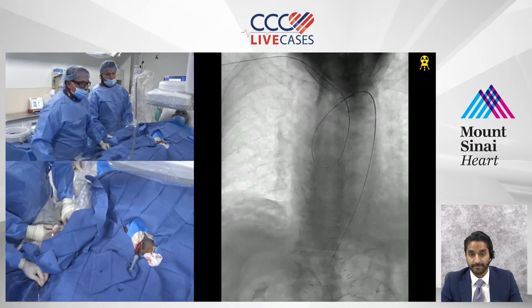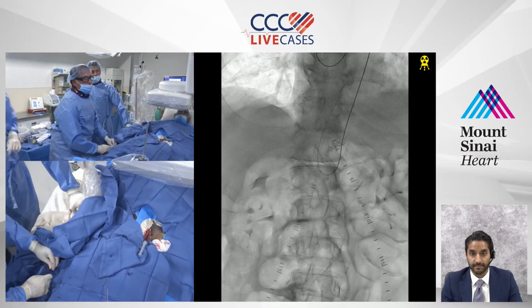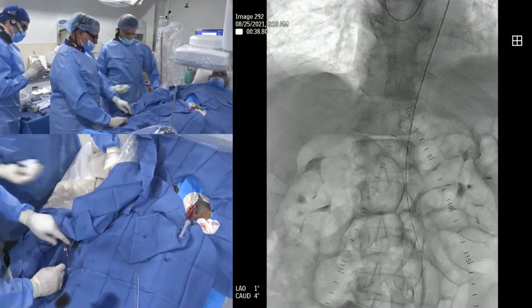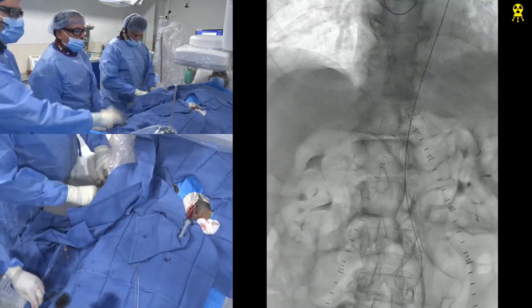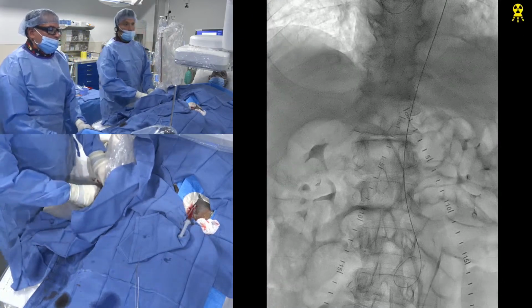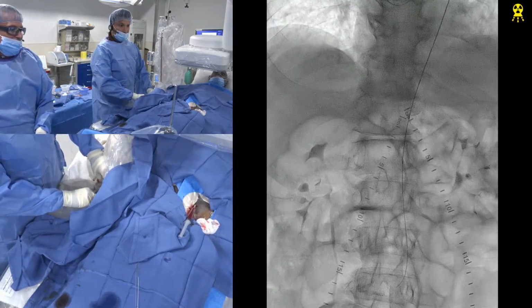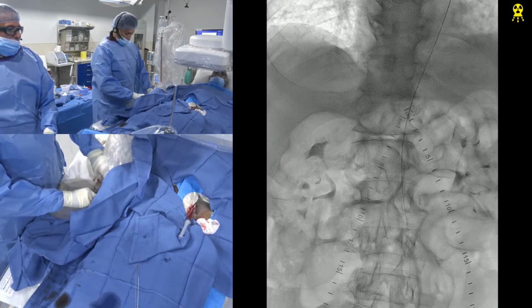We'll be okay. Come down. It's just going to be a couple extra steps. Okay. Now we've got to walk the radial out. You want me to walk the radial catheter out now? Okay, radial catheter coming out, guys. Got a nice loop down below. One second. That's why we do these cases live. Are we out yet? Not yet. A lot of resistance. Wires coming back.